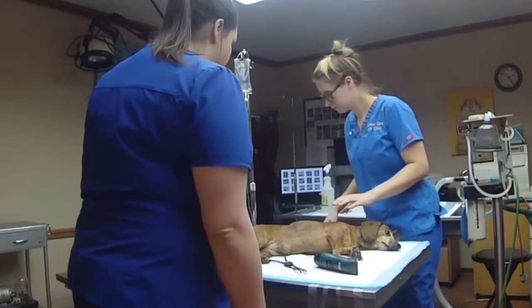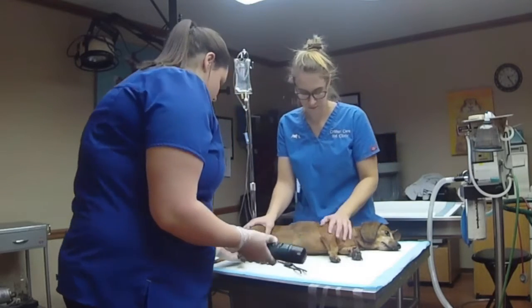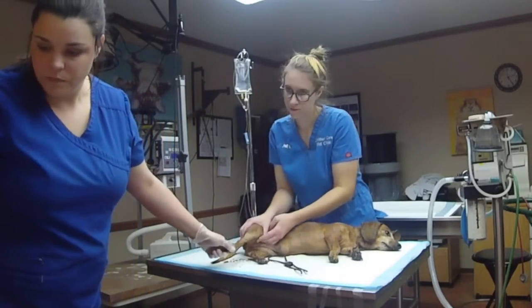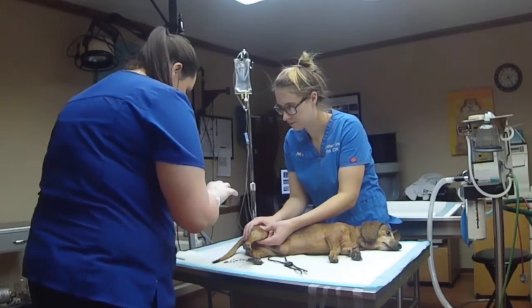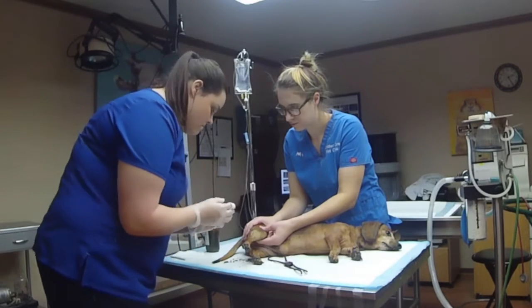I'm going to do a lateral saphenous IV catheter. I'm going to prep the area first. We are going to scrub her IV site with iodine 3 times and then go over it with alcohol.